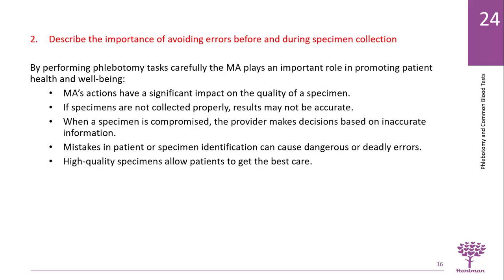So when specimens are compromised, the provider makes decisions based on inaccurate information, and that could be major malpractice. Mistakes in patient or specimen identification can cause dangerous or deadly errors. High quality specimens allow patients to get the best care. So you want to make sure you keep that in mind.